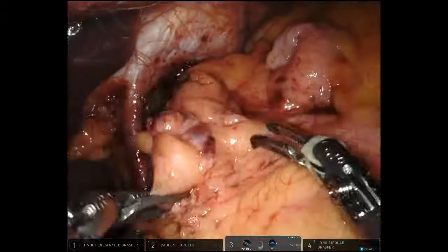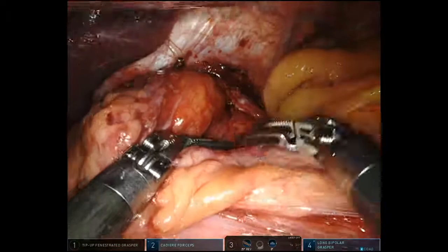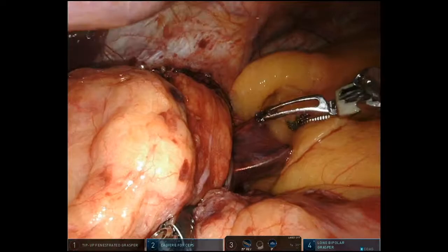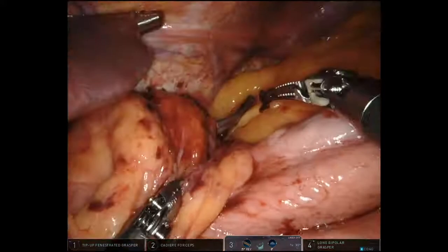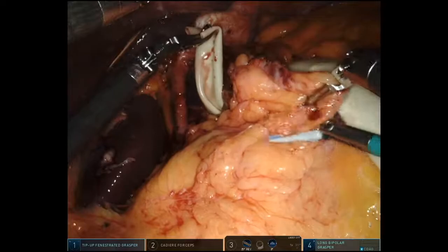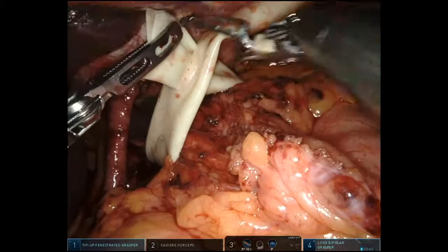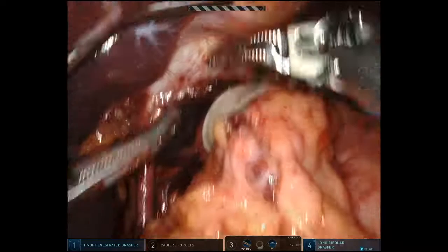Now I'm coming underneath the esophagus at the GE junction with my fourth arm, the tip-up long instrument. I'm going to get a Penrose drain around the esophagus right at the GE junction and use it as a retractor — this is a key transition in the case where I can put extra traction and really start moving along. I cut a little slit one third of the way through the Penrose drain and use it as a very gentle retractor, having my assistant hold it up.